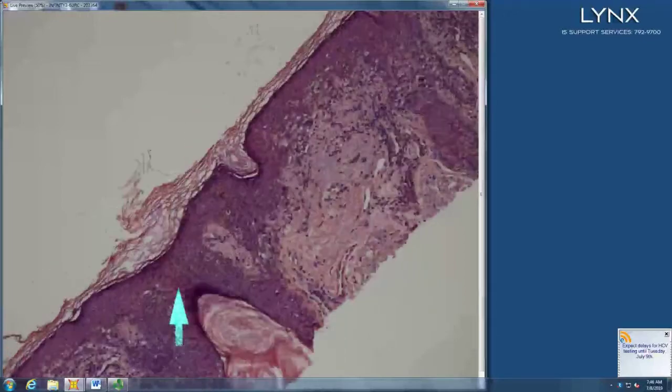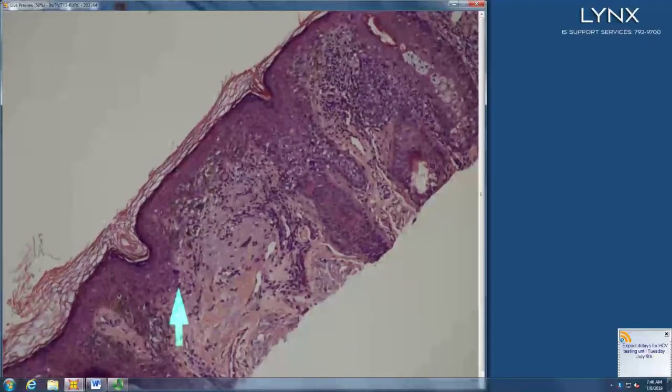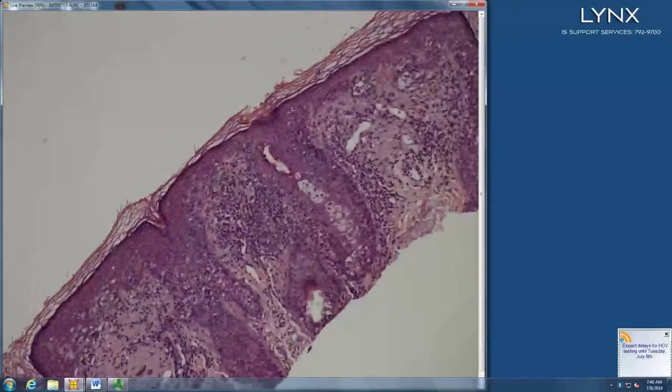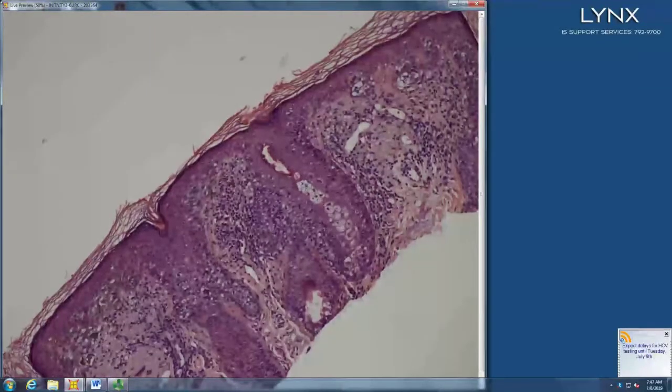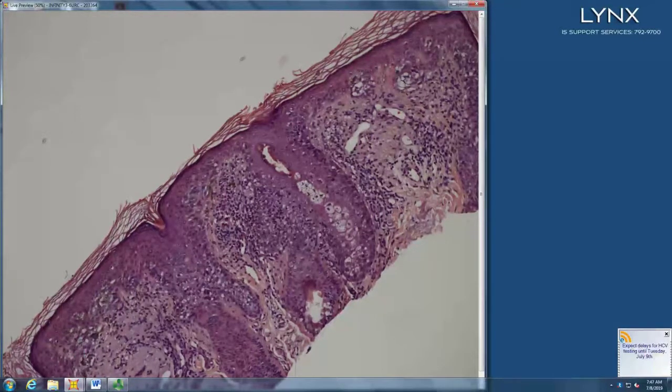There's inflammation, and it looks like there's some sort of proliferation in the epidermis. Some kind of proliferation that makes brown stuff. Yes, melanocytic. Is it exclusively tips and sides, or is it up in the arches? Within the arches. What do you know that's purely junctional on sun-damaged skin and loves the arches?